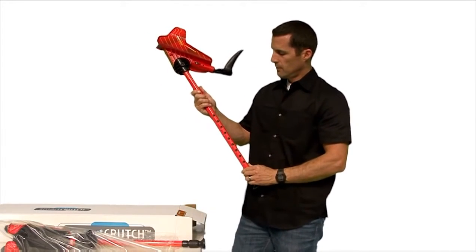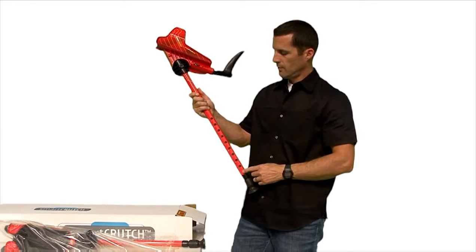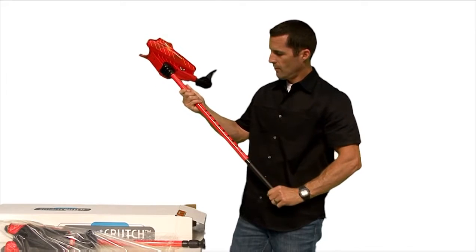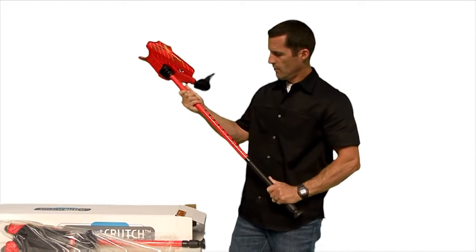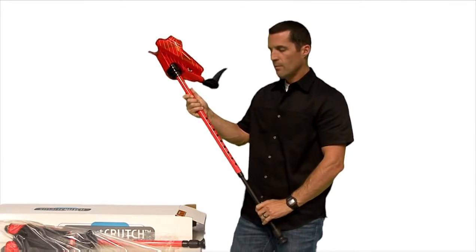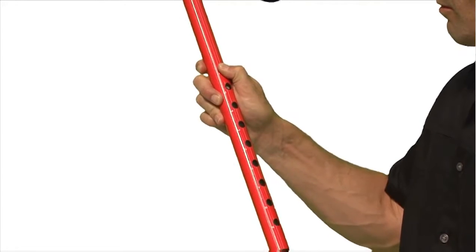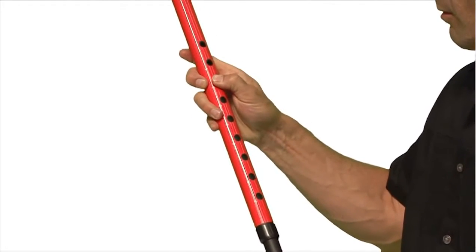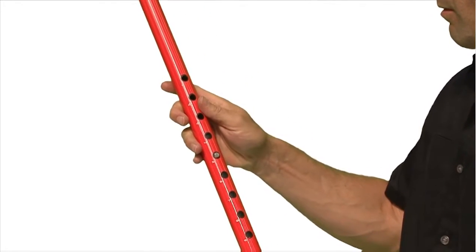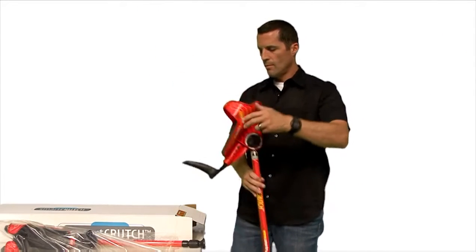The next step is to set the correct height adjustment. First, locate the height selector holes on the leg of the crutch, and then slowly slide and turn the lower leg until the pushpin mechanism pops out in one of the top holes. Once you locate the pushpin, depress with your thumb and set the height to one of the middle positions, such as number 5. Once the pin is set, place your crutch by your side.